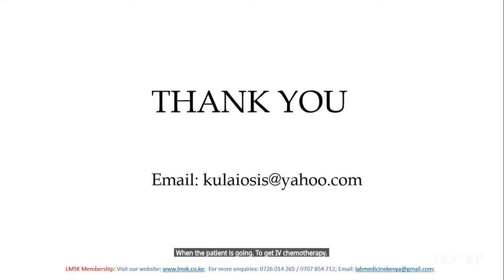And is continuing to say, we were told to remove samples on the hand on the affected side, and the patient receives chemotherapy on the other hand to avoid extravasation. I don't know, Mr. Kula, can you respond to this? Yes, or can I read it once again? No, it's okay.